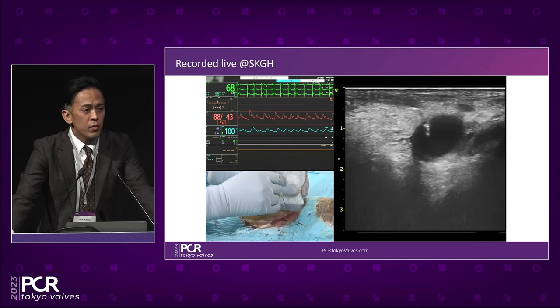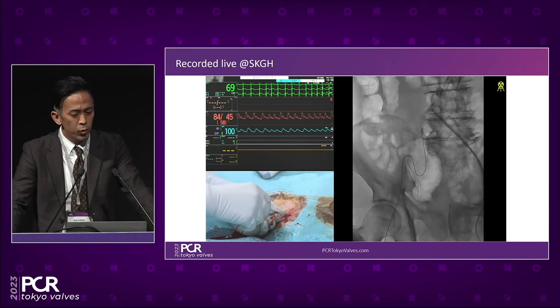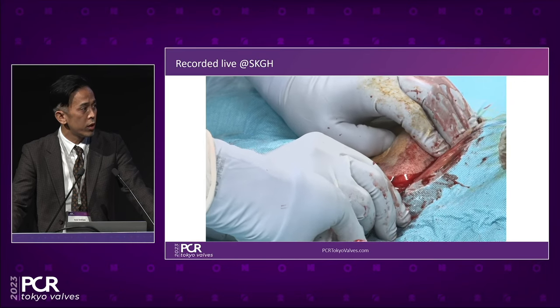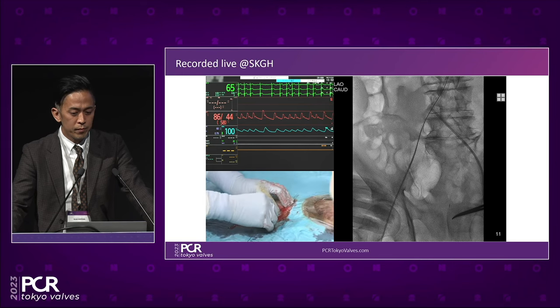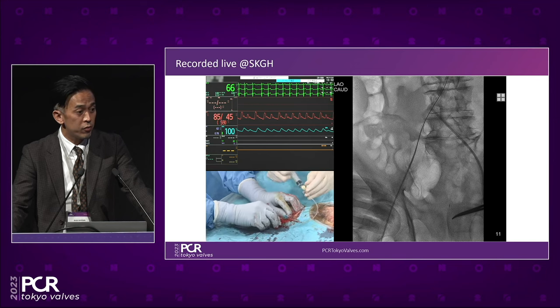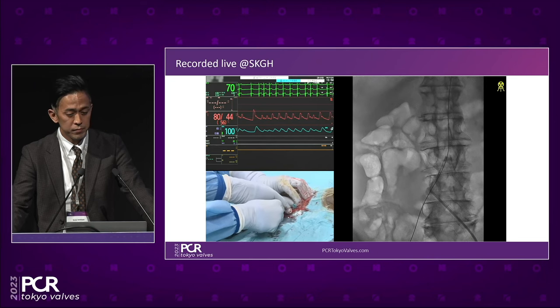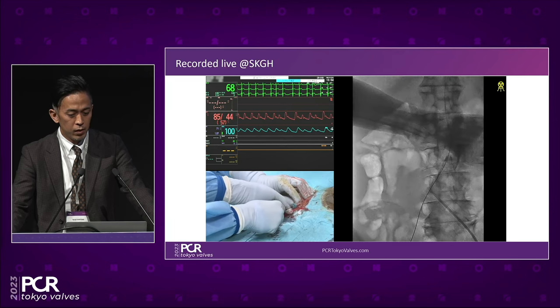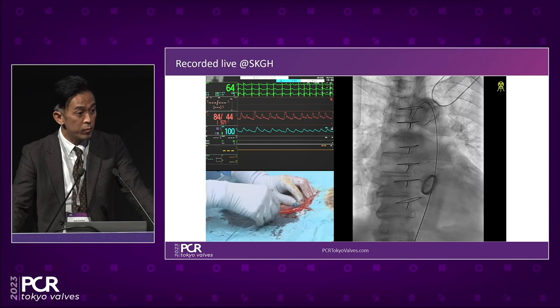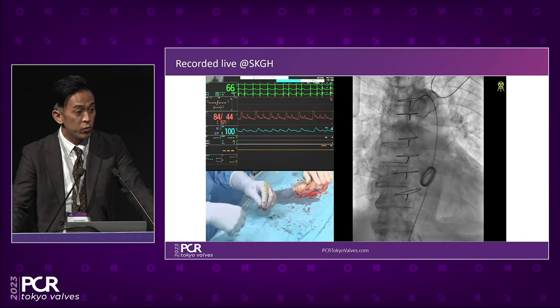In my institute, echo-guided puncture is mandatory to mitigate major vascular complications. Our operator is actually Dr. Saito. Dr. Saito did echo-guided puncture very well, and we use only one Perclose ProGlide stitch for TAVI access. And an 8 French sheath is inserted via right transfemoral access. As you can probably see in the CT data, femoral access was a bit tortuous. So we kept a long Lunderquist wire to exchange our guidewire to a stiff wire.